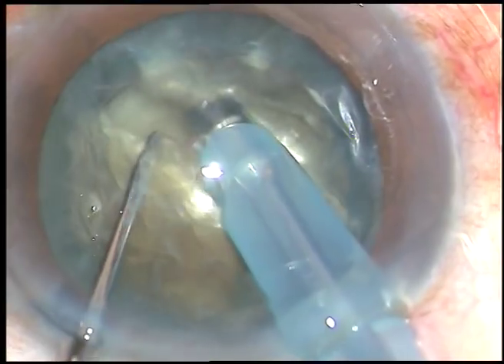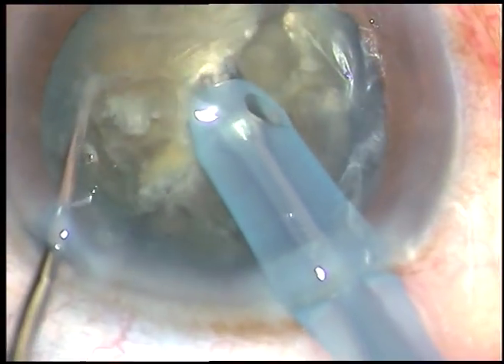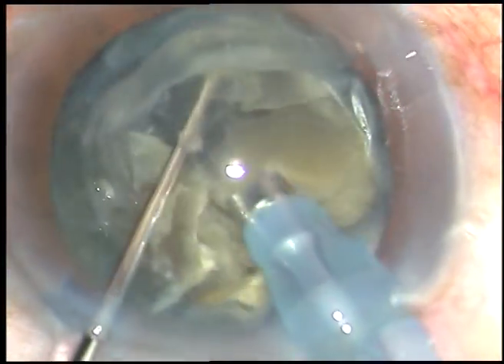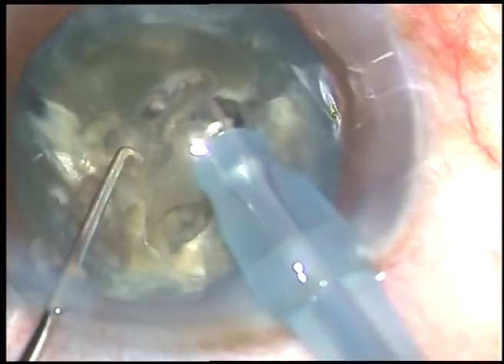Rotate the nucleus 90 degrees, hold the lower half, and divide the nucleus into two hemi-nuclei. Each hemi-nucleus is then subdivided and these free nuclear fragments are emulsified and removed.